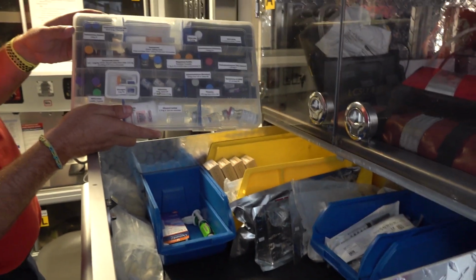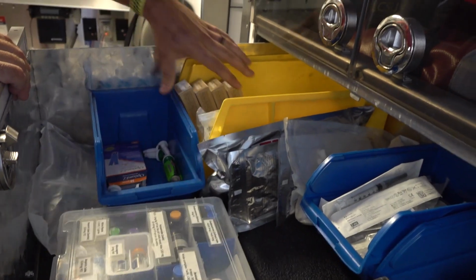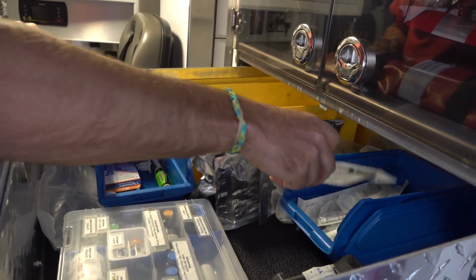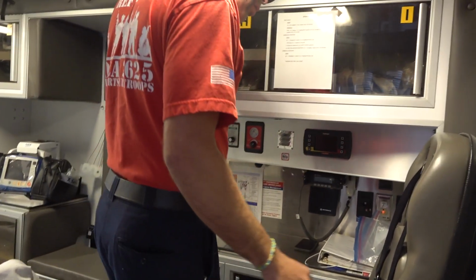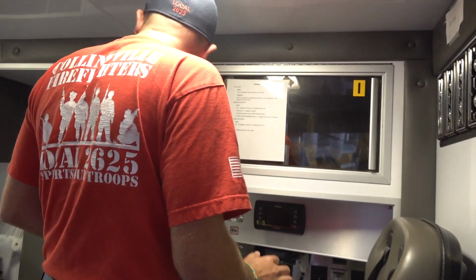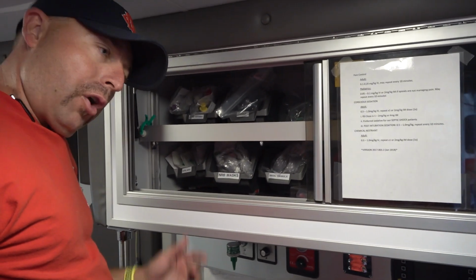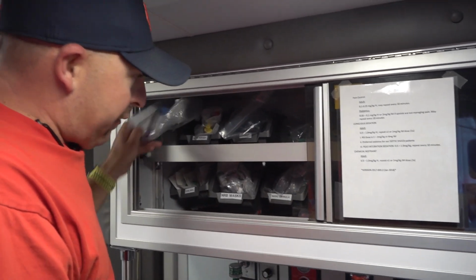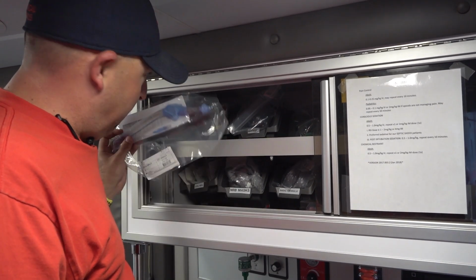We carry a lot of different medications. We have to know a bunch of different doses. We've got medicine in boxes here and different kinds of fluids and needles, syringes to draw up the medication. We'll go over here. This is our airway slash oxygen compartment. We just have different kinds of delivery devices that we put on people to get them oxygen. Different kinds of advanced airways if somebody's a critical patient that we can help breathe for them.